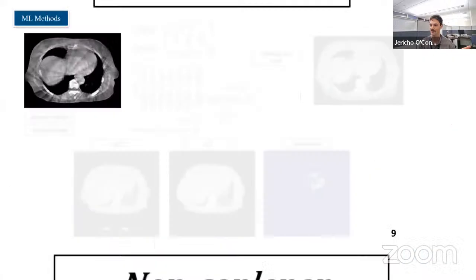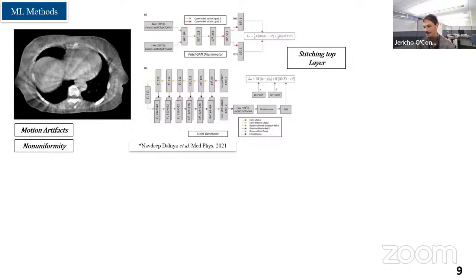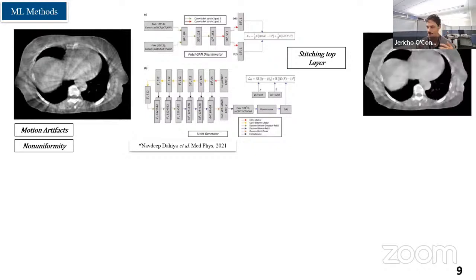So to start with the machine learning augmentation, the method that we used was a method that Johns Hopkins developed, and it has a GAN for creating the synthetic CT, but it also has a 3D U-Net for segmenting. But it only took 128 voxel cube images, so we had to do a little bit of additional work to make it accept a full volume.